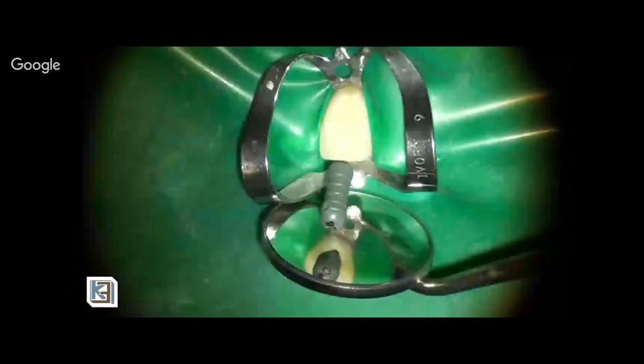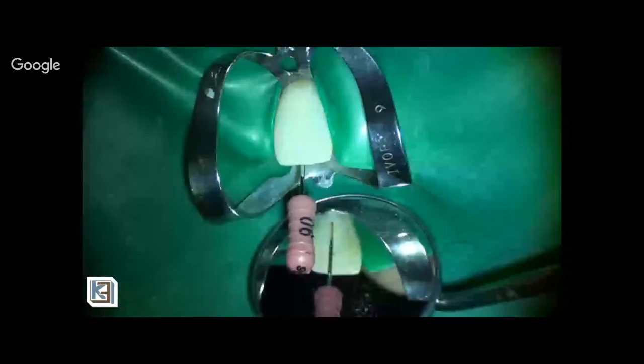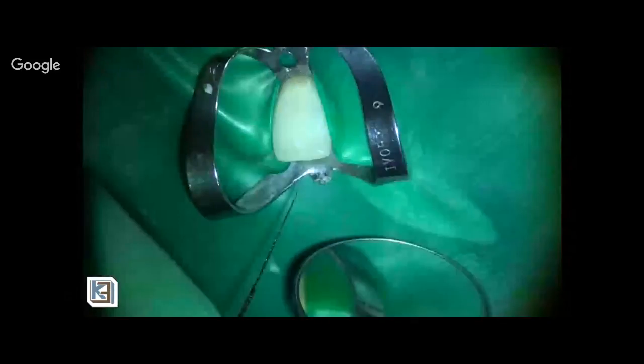Again, I was able to pop into the canal. This is my file using balanced force technique to negotiate the canal to length. And this was my first file popping through. And using longer files, the first gray file is a C plus file, and it was 21 millimeters long. So the depth was 20. That's when we pretty much popped into the canal. These are 25 millimeter long, size 6 files.